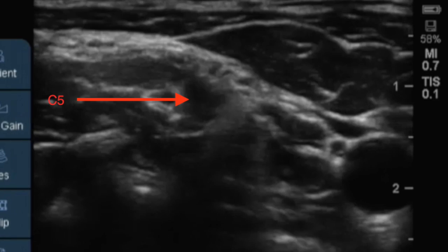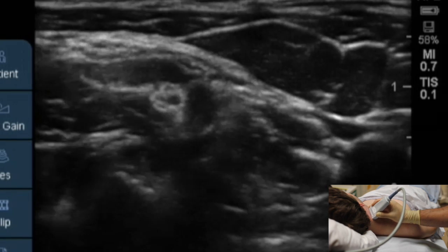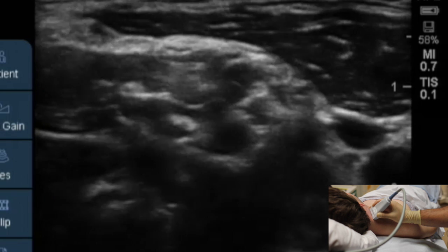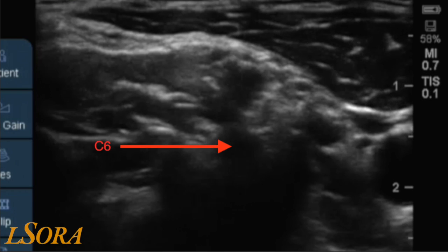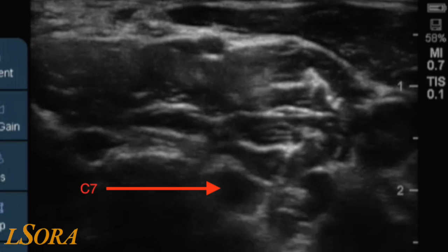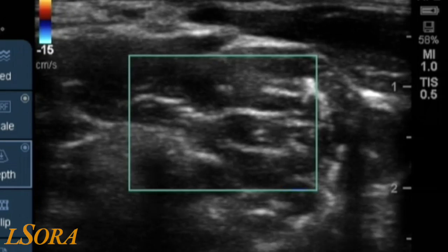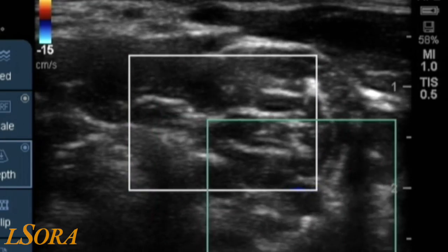Scanning up and down the neck allows you to identify C5 coming from its transverse process, and scanning further down still, C7. Note the absence of an anterior tubercle to the C7 transverse process, revealing the vertebral artery medially.